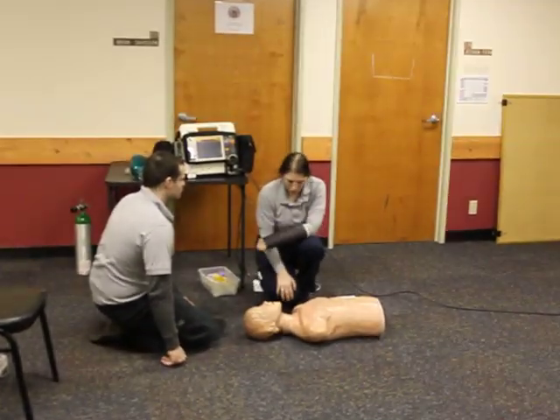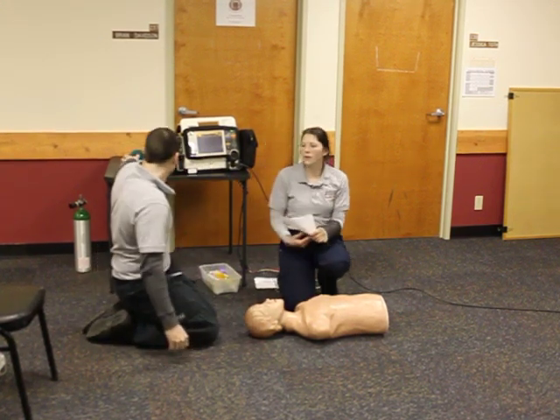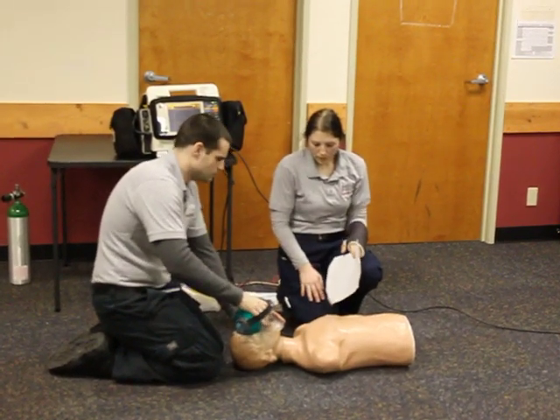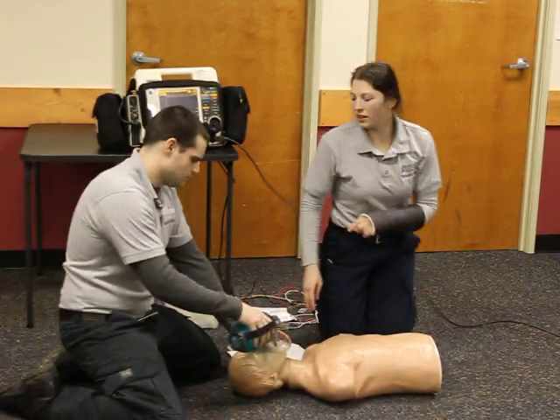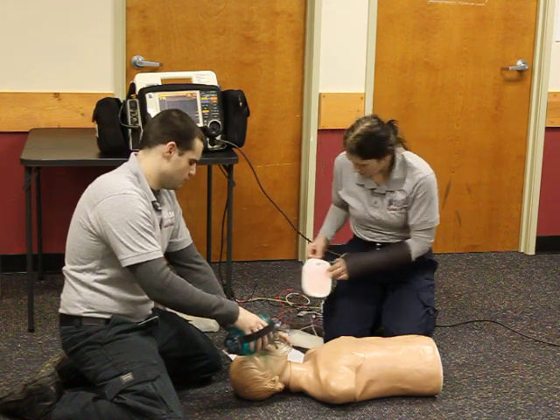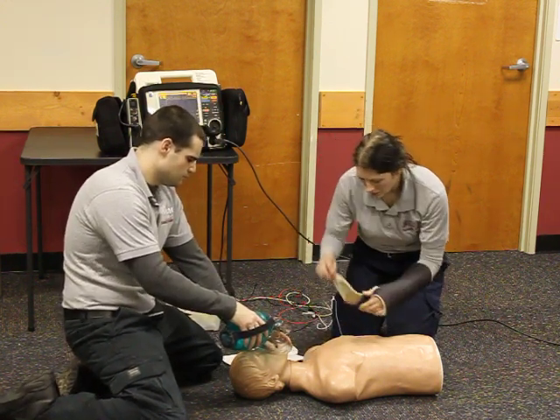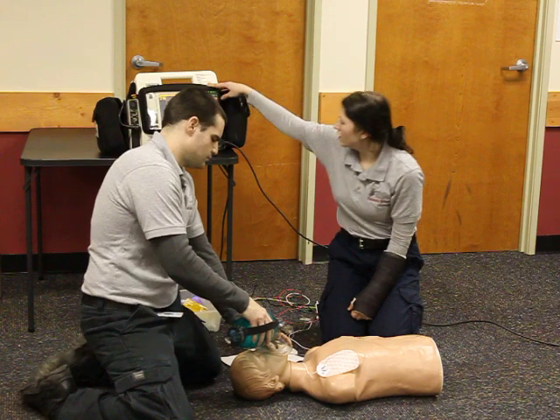I'd like to place an OPA to help keep the airway open and have my partner use a BVM to ventilate the patient, 1 breath every 5 to 6 seconds on high flow O2, 15 liters per minute. I'm also going to check the monitor. I still see he is in SVT. So I'm going to prepare to synchronize cardiovert. Once my pads are in place, I'm going to set the monitor to sync.